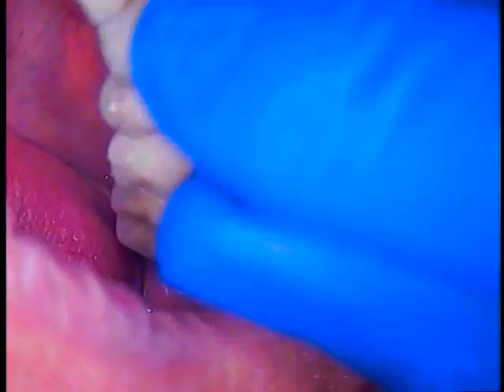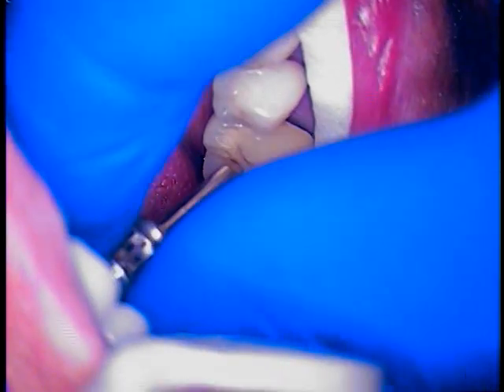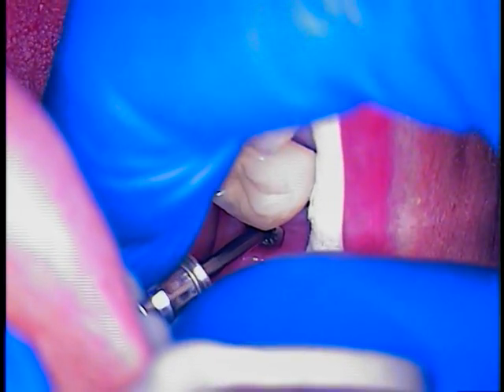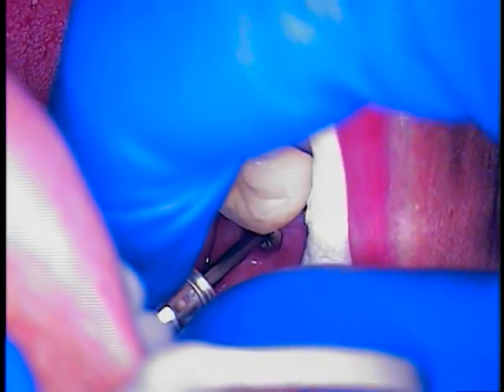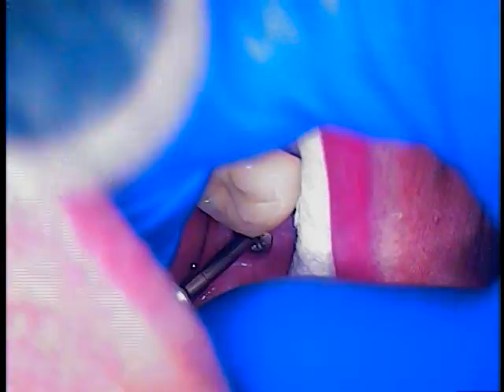Now I can go width-wise and create this path with our round bur. The other thing I want to do is try a driver, just to see if the diameter would fit — you never know if I want to slot the other portion. It's not much of a slot to do, not much of an angle.